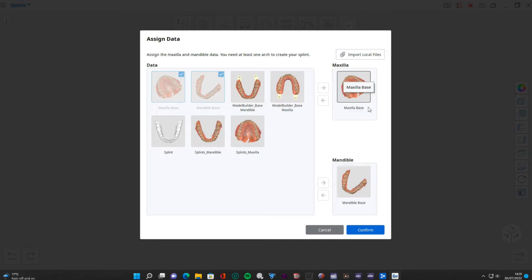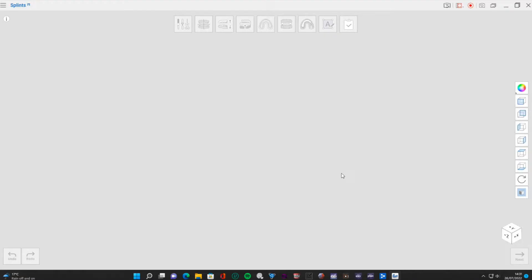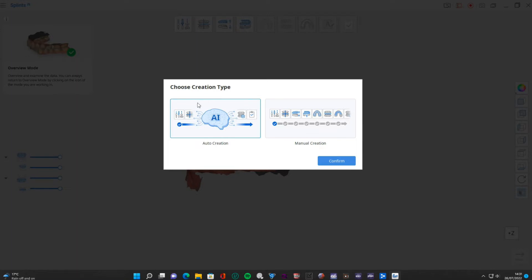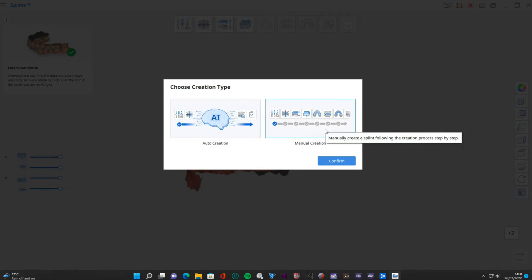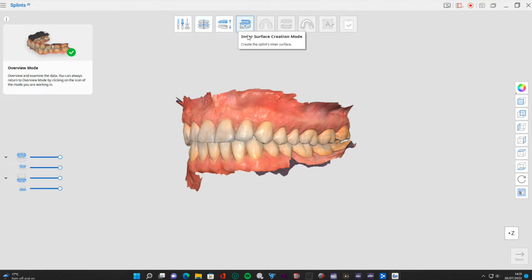It's still automatically configured so we've got the maxilla at the top and the mandible here, and we still have the option to bring in local files if we want to bring in scans from another scanner or from whichever source. We've already got these - they're from a scan of my own teeth. Let's click confirm, we're going to click maxilla, confirm. This time instead of auto creation with the AI tool we're going to go through each stage manually.